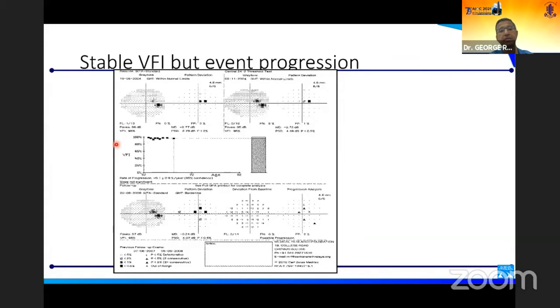This is flagged as possible progression by the machine itself once you have more than three points getting worse. Here you have something with a stable visual field index. There is no trend abnormal, but you are seeing points on the event analysis which are abnormal. So you need to look at both together because if you have very localized change, it may not be enough to change the VFI significantly to generate a trend analysis. You need to look at both in order to take a final decision. So you have a stable VFI with localized progression.